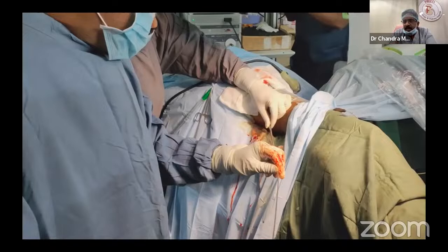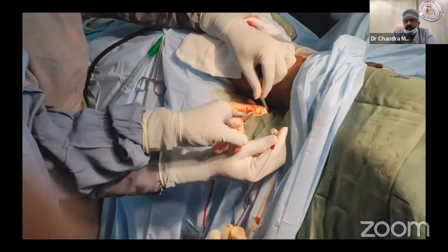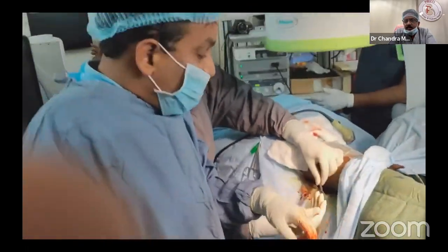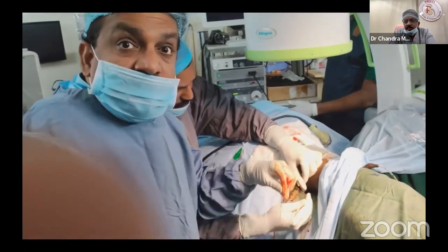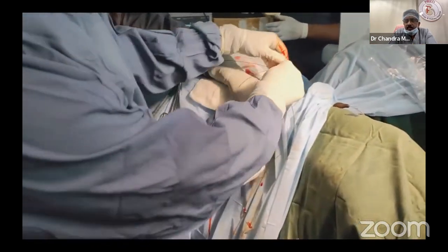You should be able to easily identify torrential bleeding in children. Even 100 ml blood loss is not acceptable. This is a child PCNL. He is holding, and torrential bleeding should not happen here. So he will put saline now, and he is pushing inside, otherwise the guide wire will slip. The guide wire especially will slip.